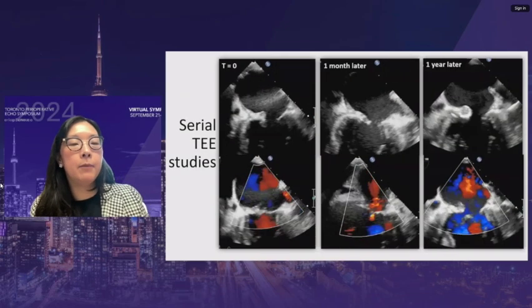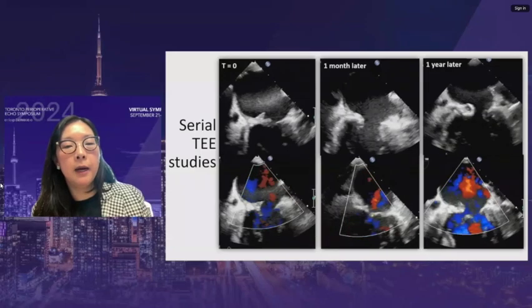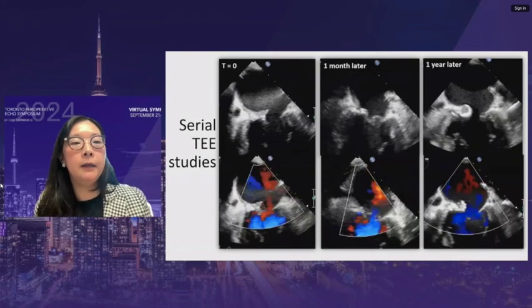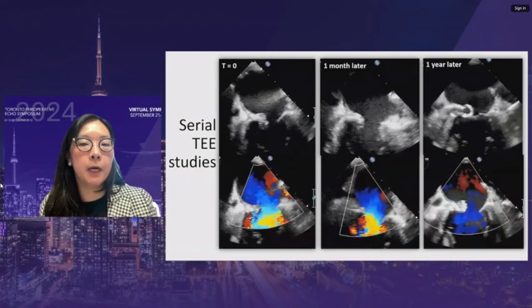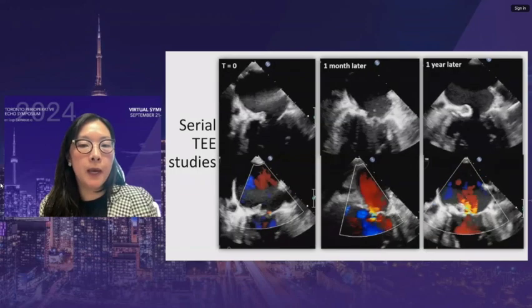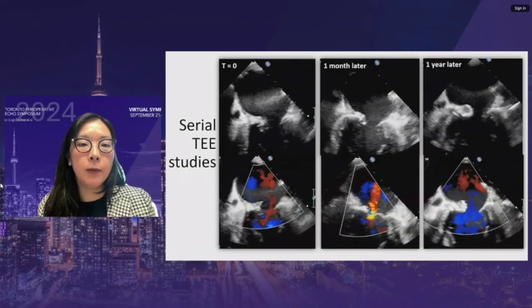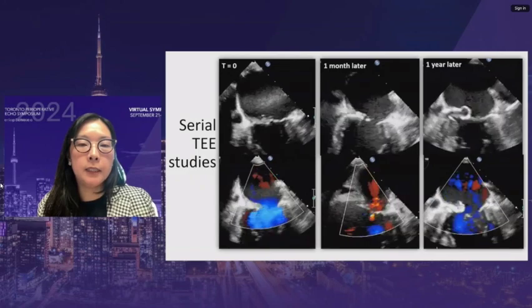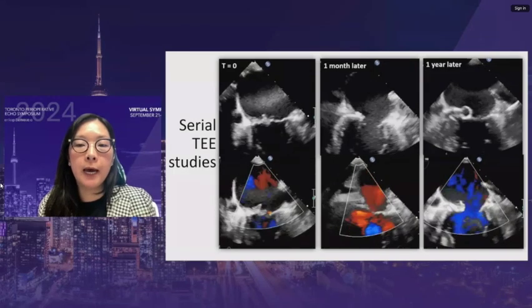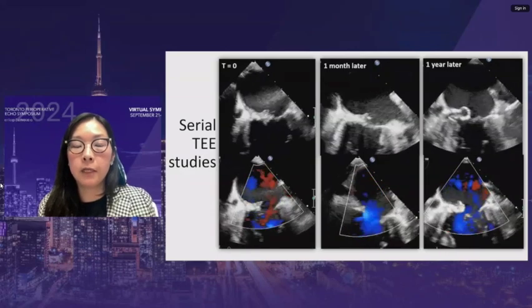This case demonstrates the value of serial studies: a patient treated for infective endocarditis who declined surgery. Serial studies were performed because she was being evaluated for organ transplant. A native valve with calcifications has a vegetation on the mitral valve leaflet with a mobile mass but little mitral regurgitation. One month later, there is more thickening and extension to the annulus. About a year later, a cavity has formed — expansion and cavitation from infection — yet significant mitral regurgitation still did not develop.